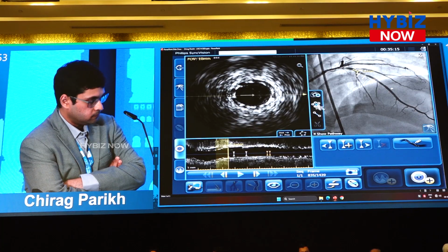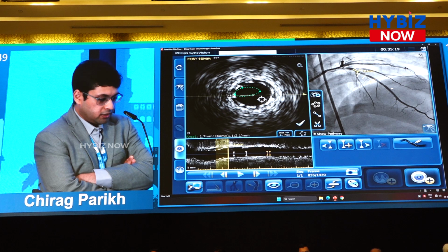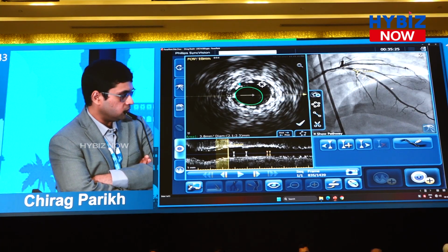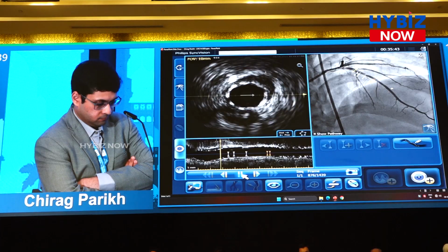Ruptured plaque makes it a new atherosclerosis. So there is an entity described called lipidic neoatherosclerosis, and that has poor prognosis. And we do expect this in this case, a 34-year-old having CAD, aggressive atherosclerosis.